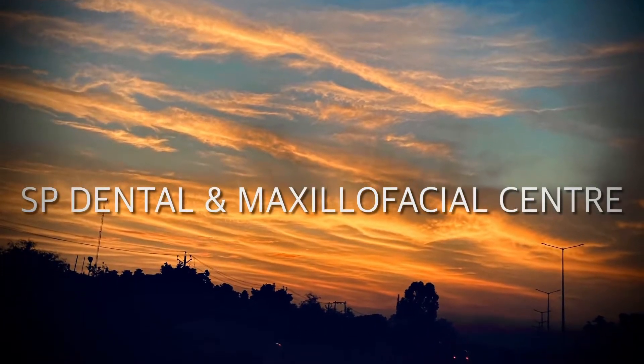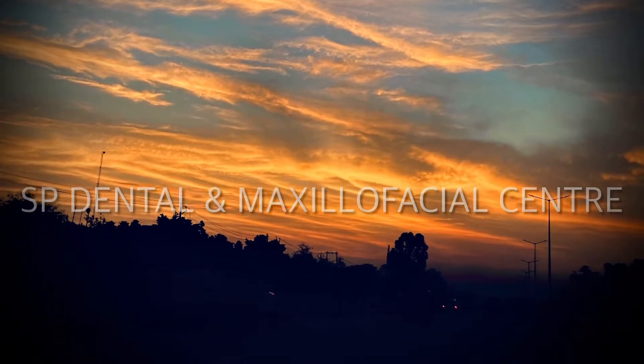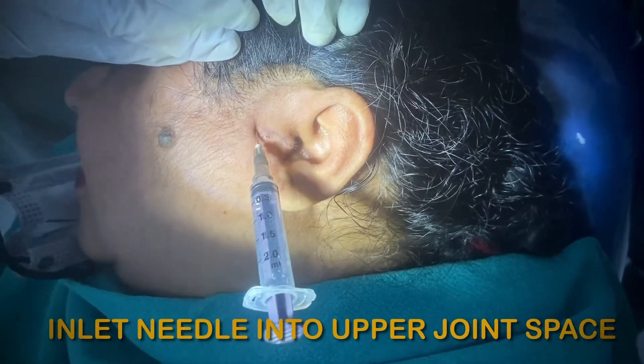Hello everyone. Today we are demonstrating a procedure which is called arthrocentesis. It is basically a minimally invasive procedure used to relieve the pain of the temporomandibular joint.